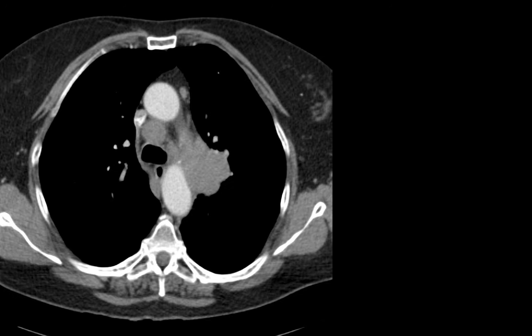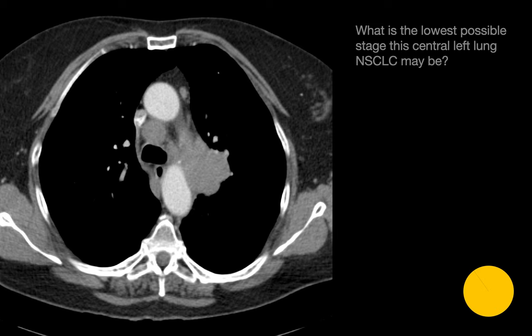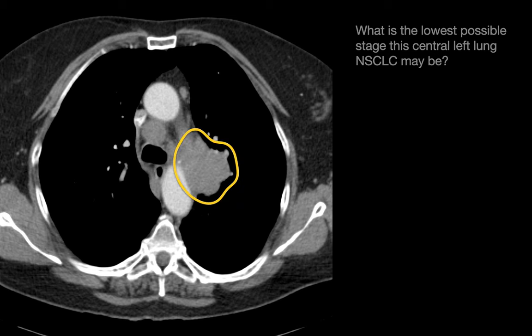This is a non-small cell lung cancer case. What's the lowest possible cancer stage this central lung cancer case may be? The imaging features include a central left lung mass that appears to invade the left hilum and mediastinum, and a bulky mediastinal lymph node that almost certainly lies to the right of the left lateral tracheal wall. The left lateral tracheal wall distinguishes right from left mediastinal lymph nodes superior to the tracheal bifurcation, making the bulky lymphadenopathy contralateral to this left-sided primary lung cancer. Contralateral mediastinal lymphadenopathy results in a non-small cell lung cancer stage of at least 3B.